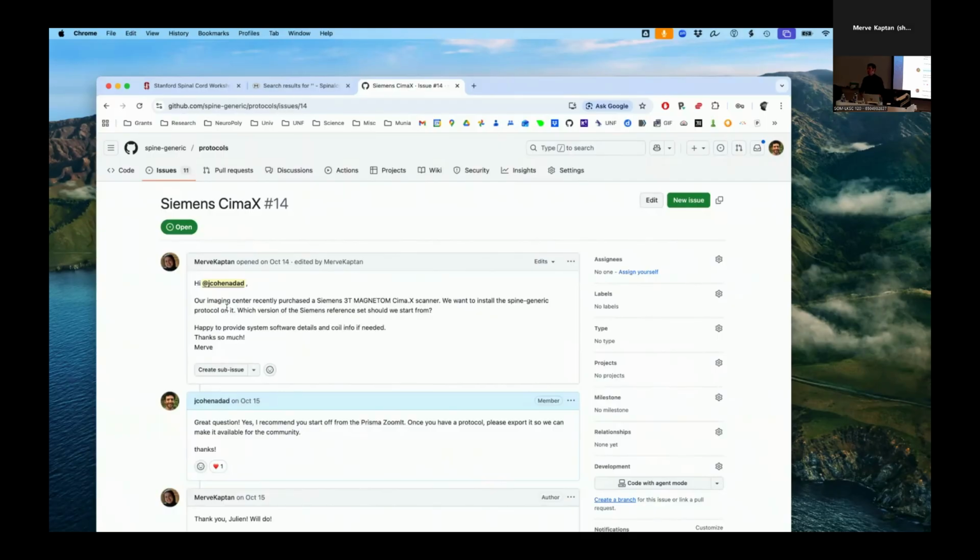But that's what's done clinically. The big difference with the T1 and T2 weighted imaging in the generic protocol is that it's 3D and much higher resolution, allowing better quantification of the cord morphometry. But we see these 3D sequences used occasionally, but not always. And I had a conversation with Hugo about this, and I'm really looking forward to getting his thoughts on why they don't use the 3D imaging.